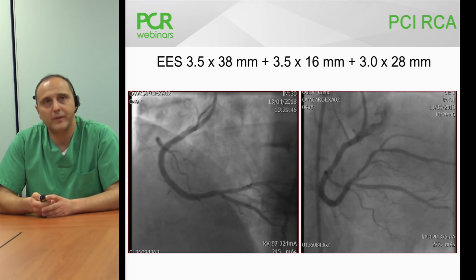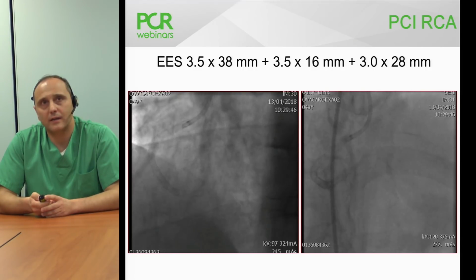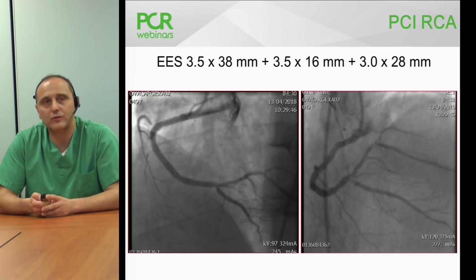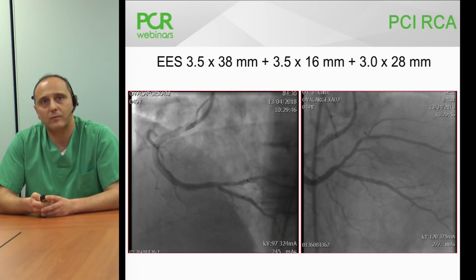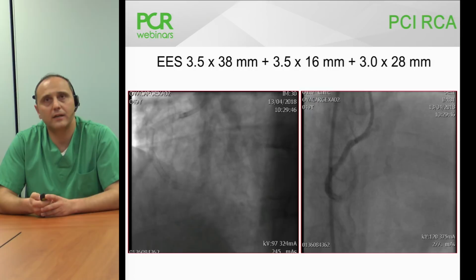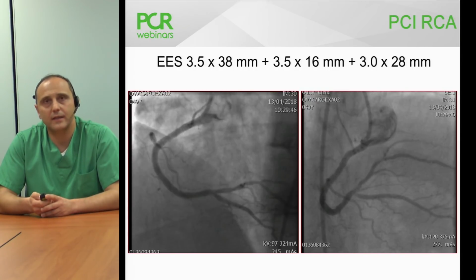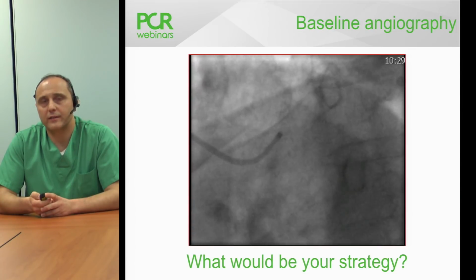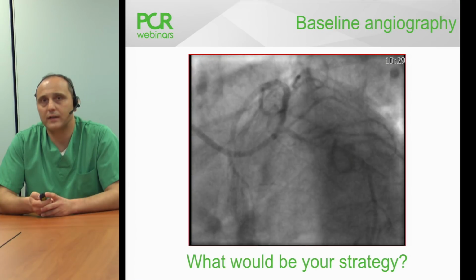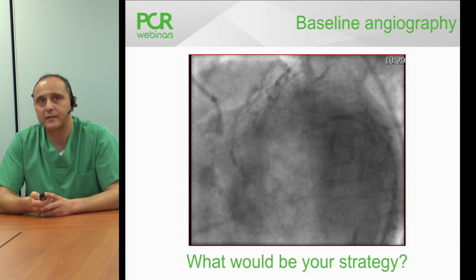What we have already performed previously, at the time of the coronary angiography, was the PCI of this right coronary artery. We started intending to implant one long stent in the proximal lesion, but due to some sort of fragility of the vessel wall, there was some edge dissection that pushed the operator to implant an additional 2 drug-eluting stents. And this was the final angiographic result. What we have to deal with now is this disease of the left main. Any comment at this stage from your side?